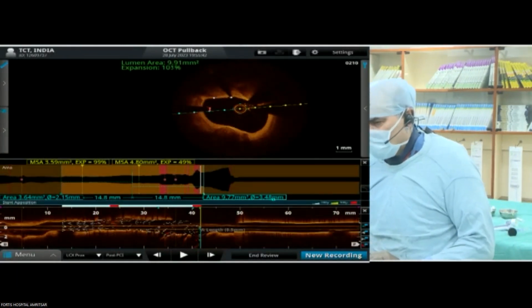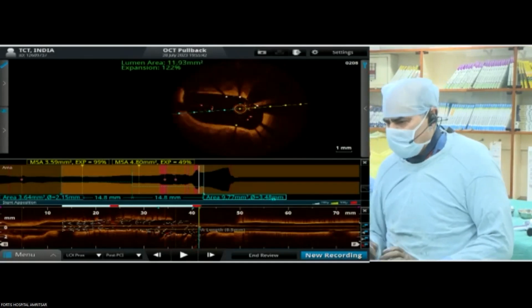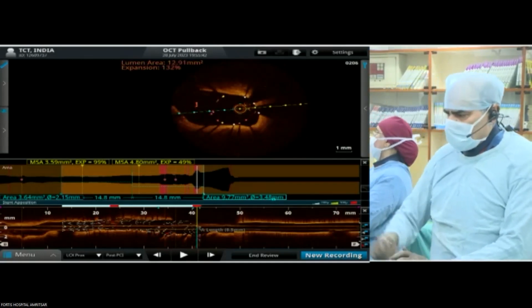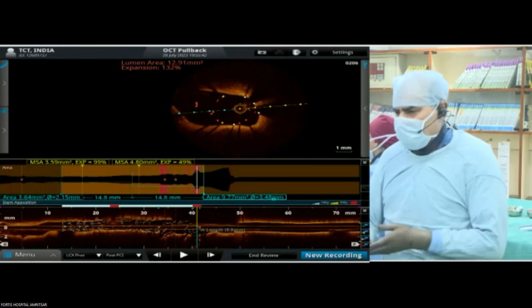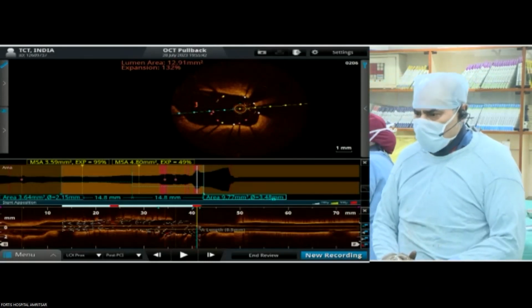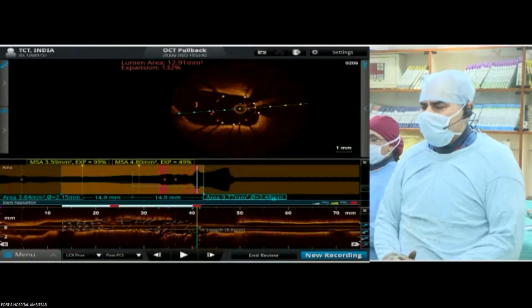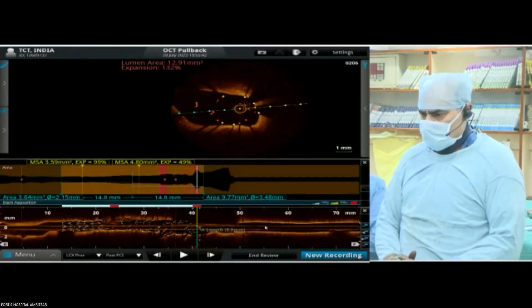Yes, go back. Go to 6. Go back. Yes, see there. So I think that should not happen. Okay, that's the circ ostium. So what do you suggest? If a few struts are hanging, it is still acceptable, but under expansion or malposition like a figure of eight.